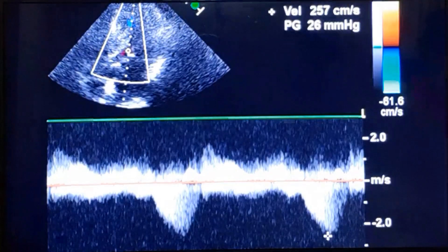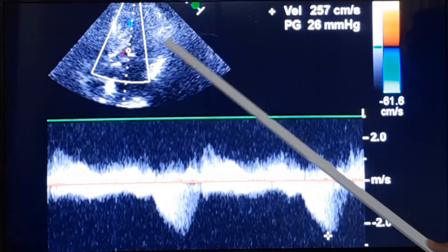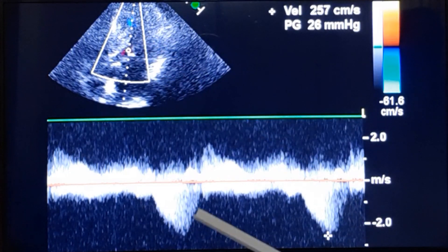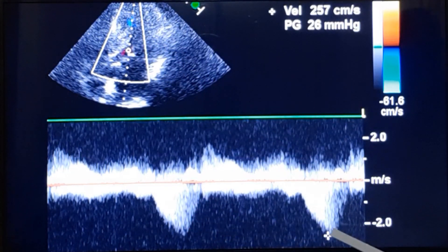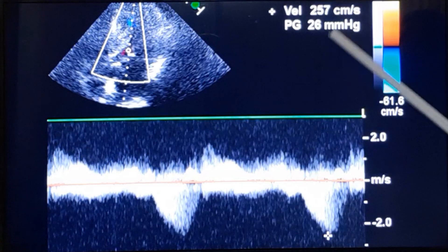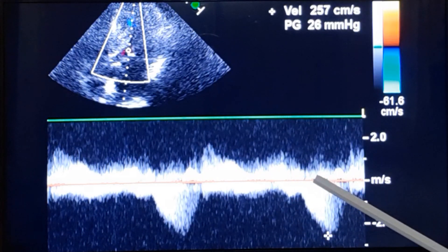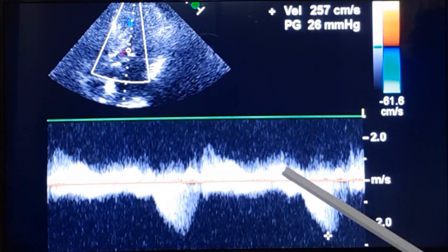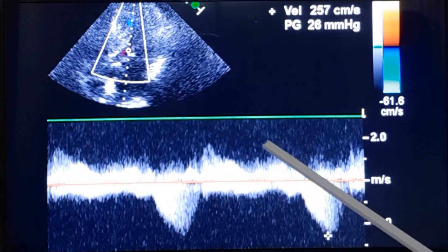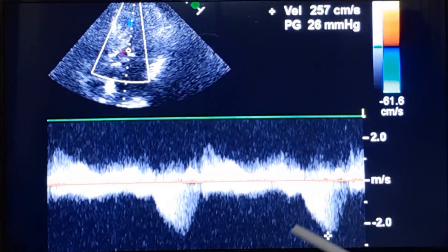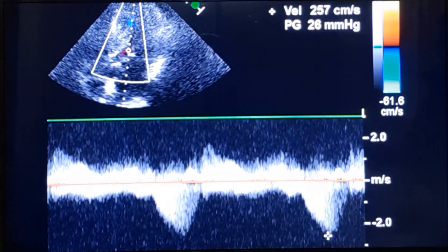This is the gradient across the left ventricular outflow tract in the same patient, measured as 26 millimeters of mercury — that is not a very high gradient. And the gradient in hypertrophic obstructive cardiomyopathy is not a static gradient; it is dynamic.